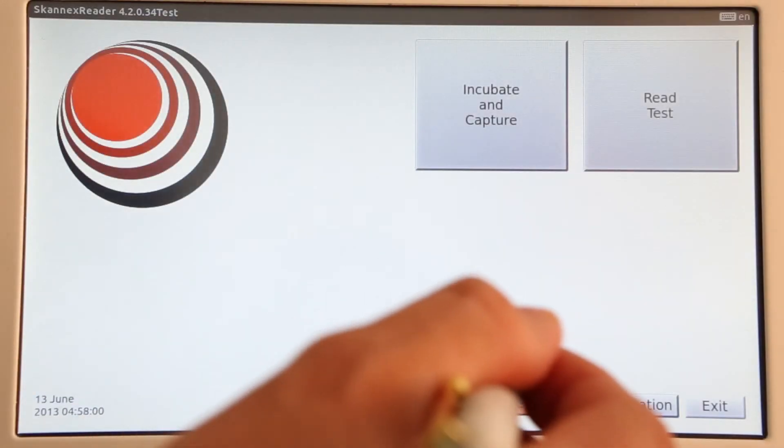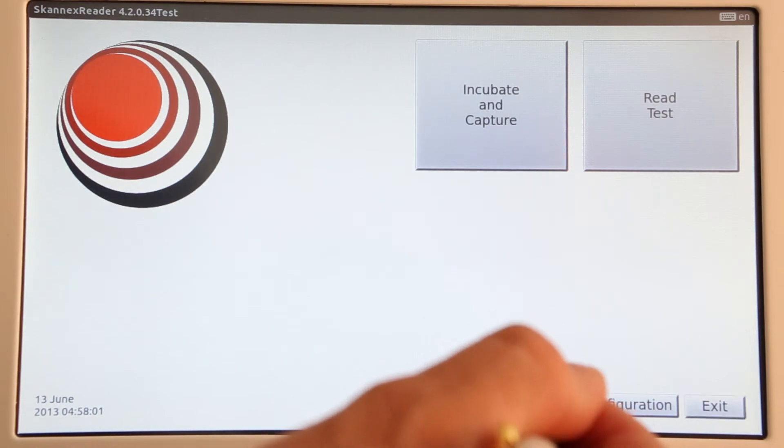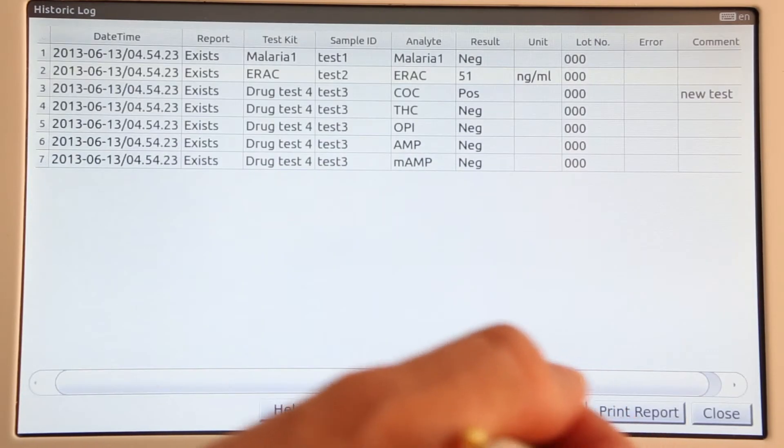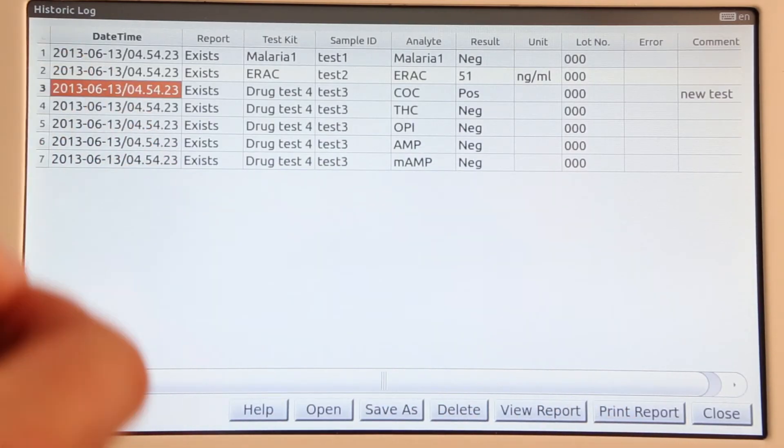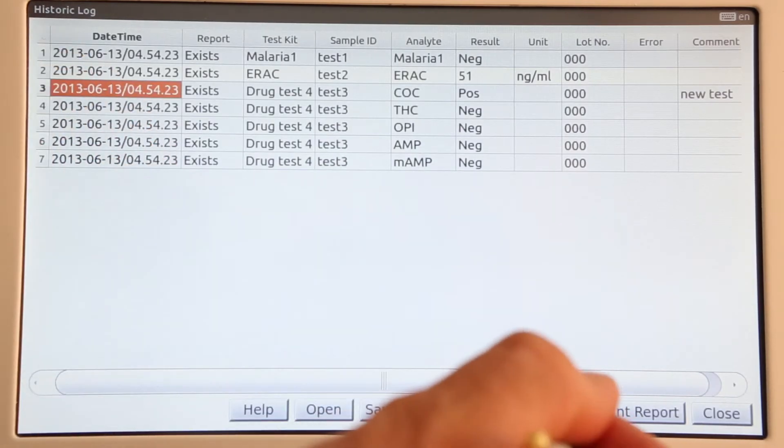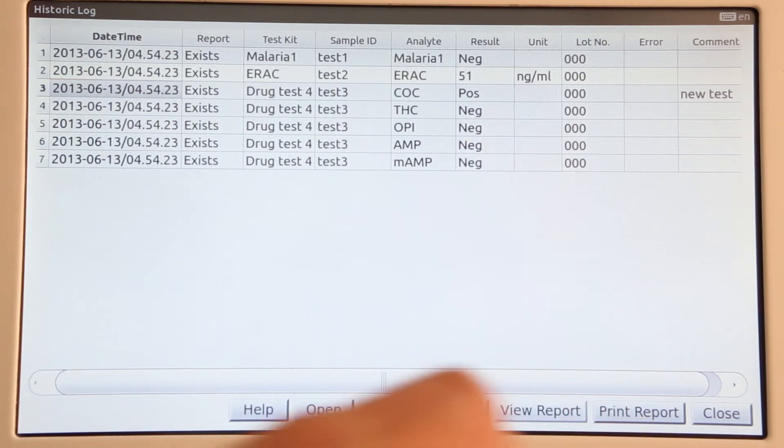Tap View Log to find all results listed. The View Report function opens a report preview.